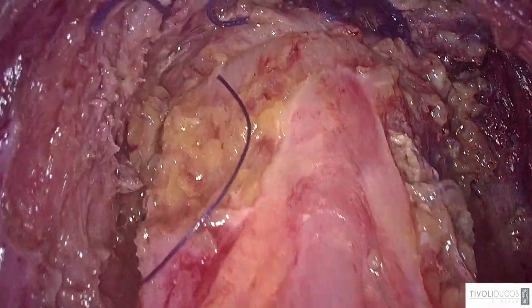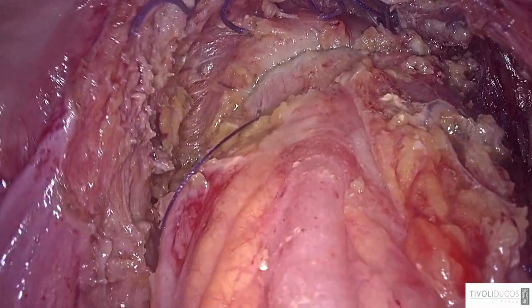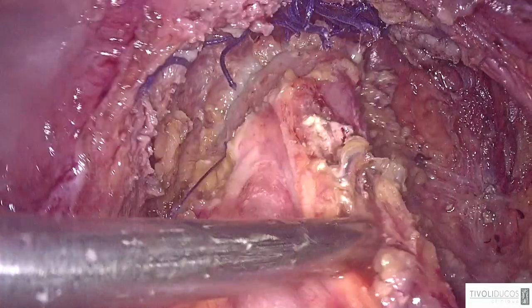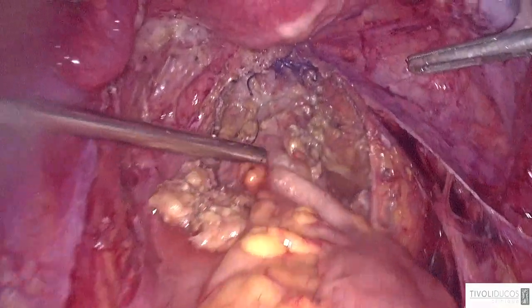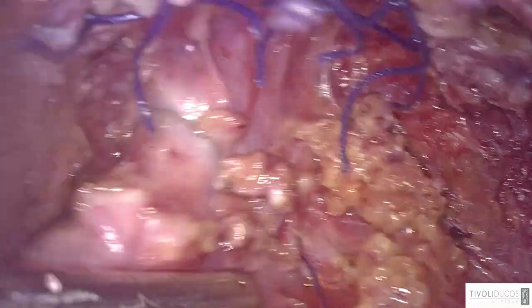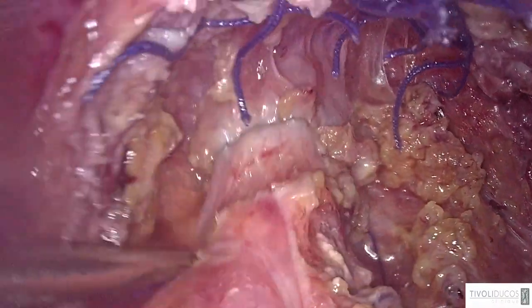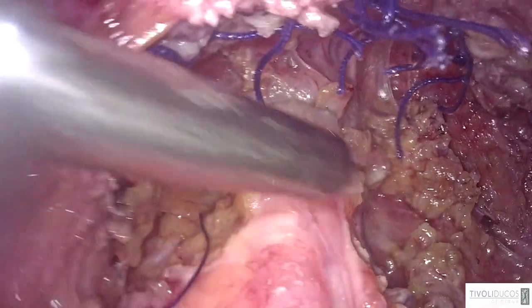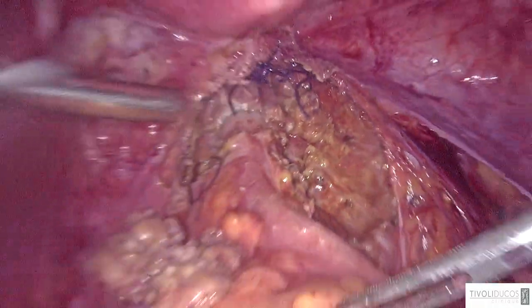And then he will open the stapler, and he will remove the stapler with the piece into the stapler. And you see, we have a suture, very well done, suture of the anterior rectal wall. Very, very, very important, this kind of suture never led to stenosis. Never. It has never happened in more than 290 cases.